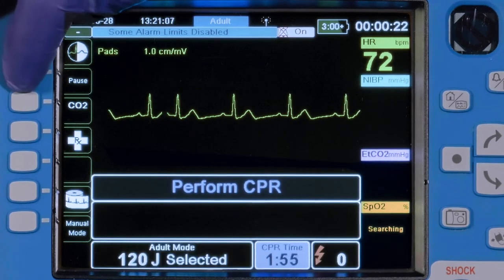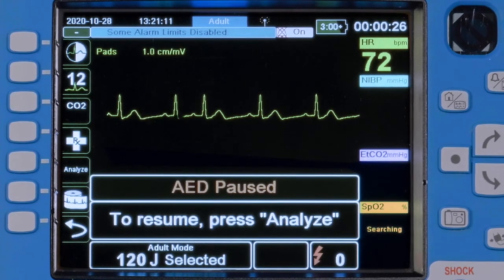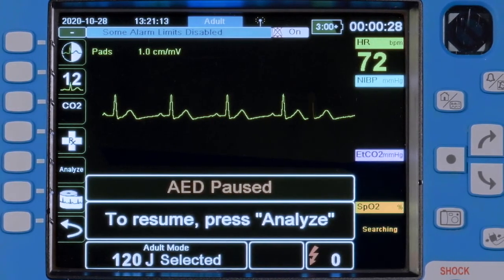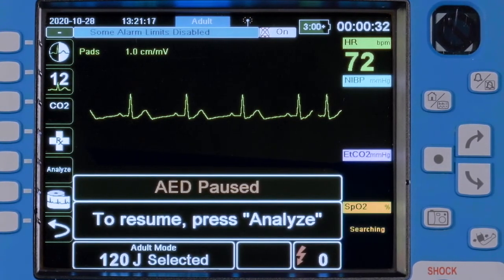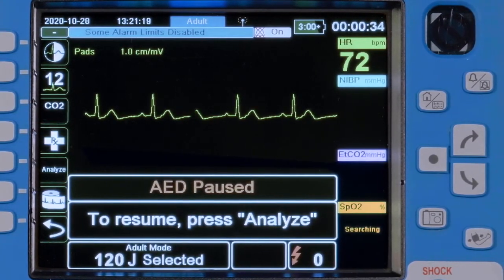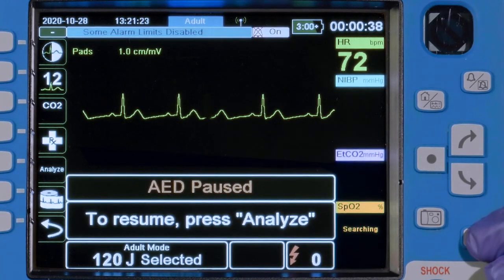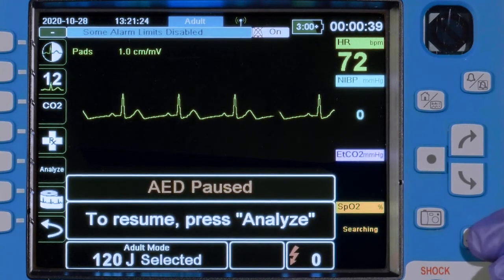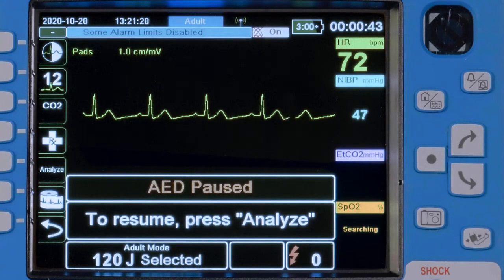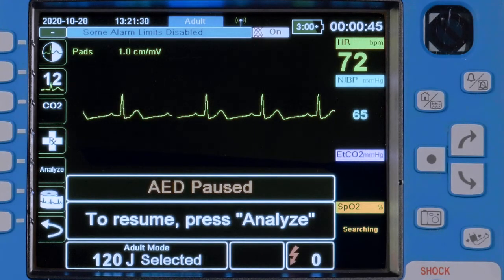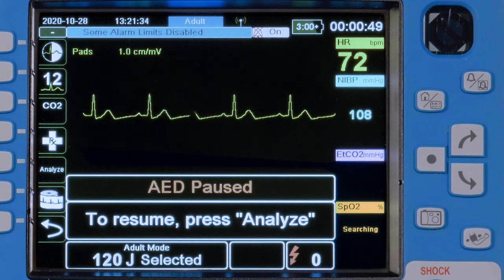If return of spontaneous circulation is achieved, press the Pause button to pause the AED cycle and enter the monitoring mode, which provides access to ECG monitoring, 12-lead ECG, non-invasive blood pressure, pulse oximetry, and capnography. During the pause in the AED cycle, the X-Series Advanced continues to monitor the ECG rhythm in the background. Please note that the available monitoring parameters could change based on configuration.